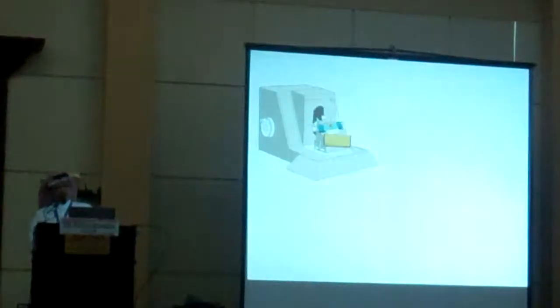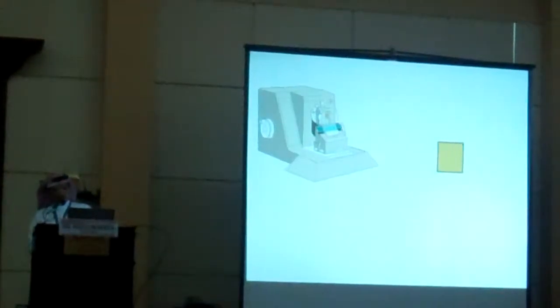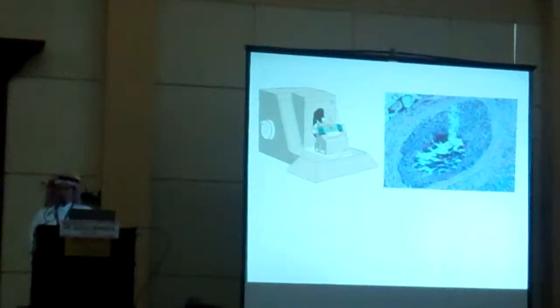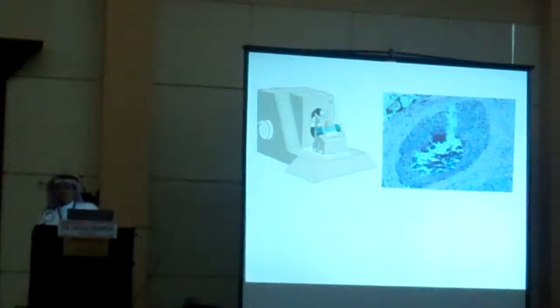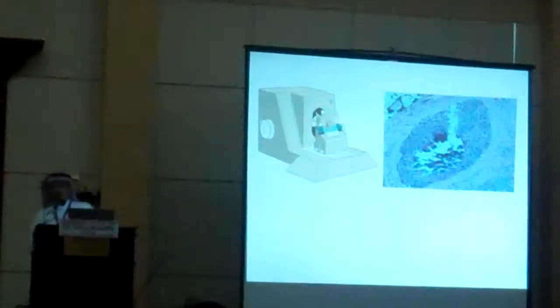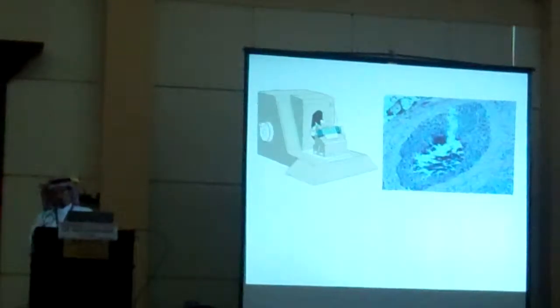In the pathology departments, when we receive the specimen, it's cut. When they cut the sections, as I told you, we only see 3 microns. We don't really go deep in the block. As a routine, we cut 5 levels and 3 slides, and this is for all core biopsies. But don't expect all pathology departments are doing the same thing.